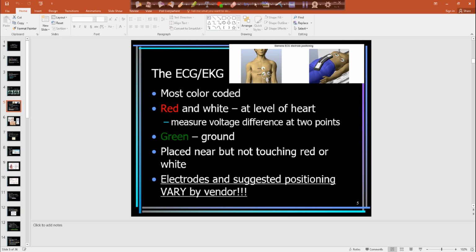So just a quick review. We will be going over the different planes and slices of cardiac next semester. This is really just a particular lecture on how to compensate for that basis, which we just went over. All right, so these EKG leads, every vendor has different ones. Most of them have 4, some of them have 3, but usually the black goes over the what?